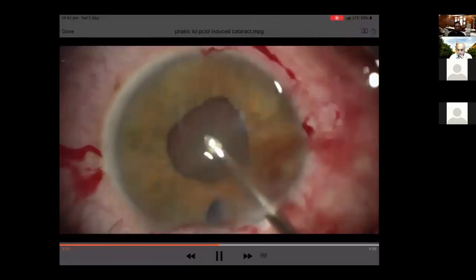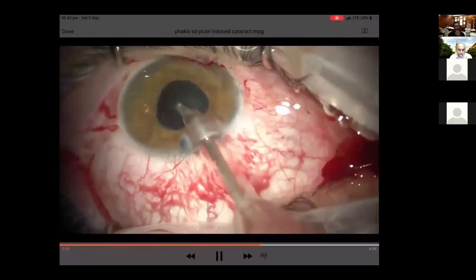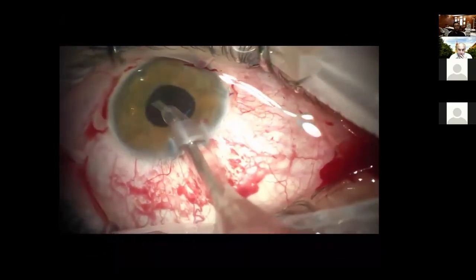The rest of the procedure is more or less the typical cataract procedure, and the nucleus here is quite soft, so I do not need to use a chopper in order to remove this quite soft cataract, as the patient is quite young.